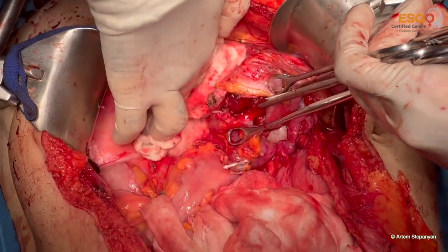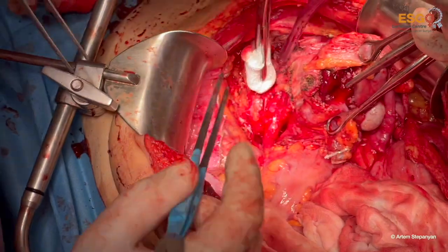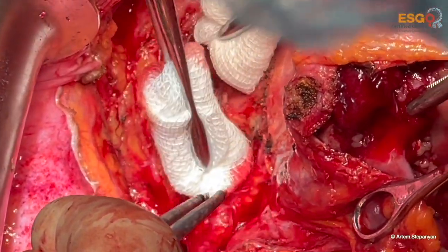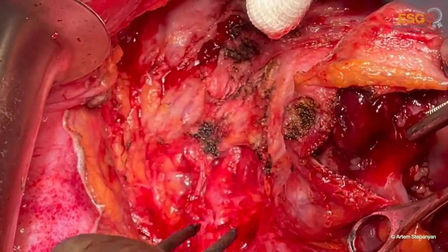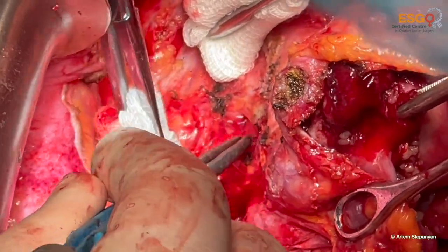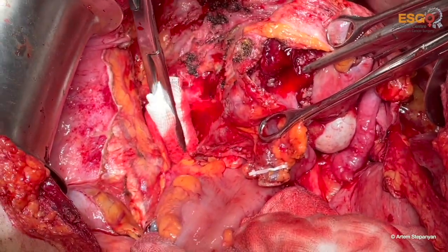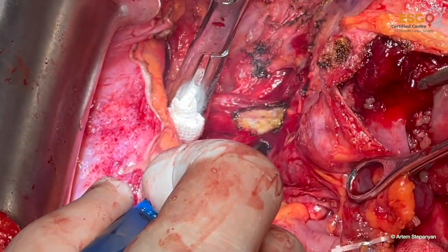And we're going to perform the same procedure on the opposite side. The small bleeders are coagulated. We spare the ureteral sheath and ureteral vascularization, which is very important. Again, the ureter is very sensitive to devascularization and thermal damage.